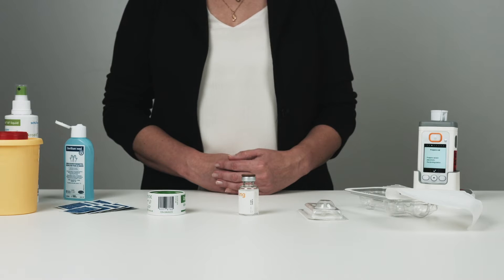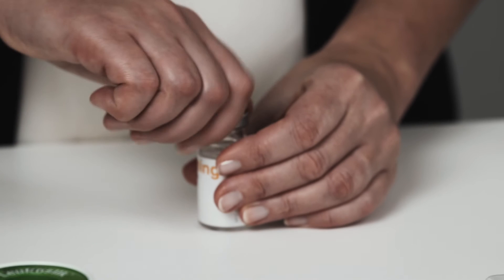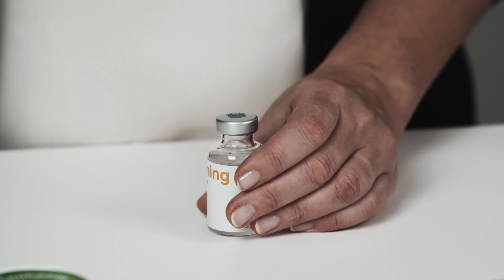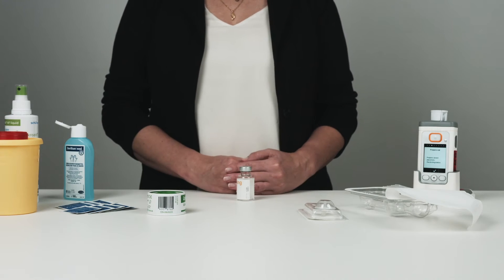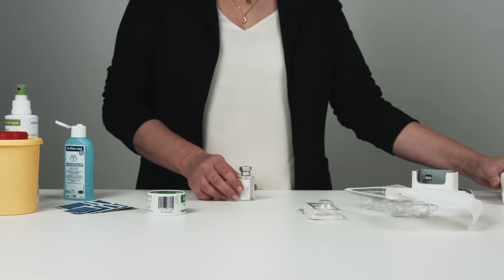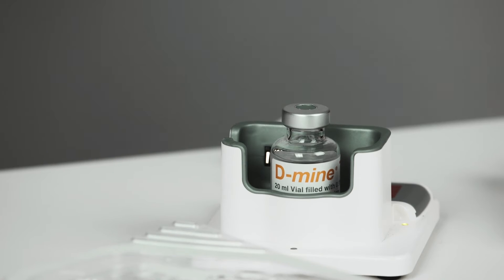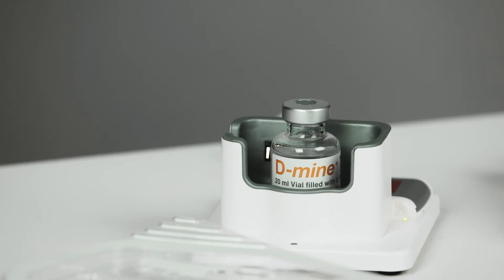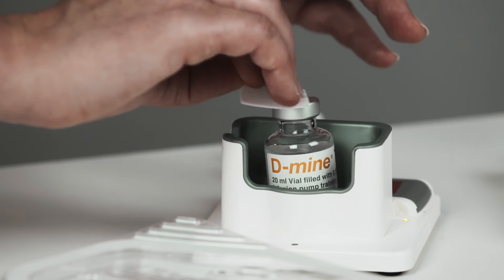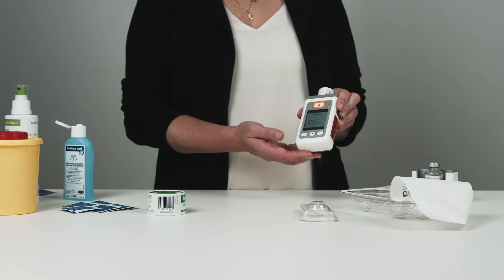Once the self-test is complete, prepare the apomorphine. Take the vial with apomorphine and remove the cap. Make sure you don't touch the top of the vial. Place the medication vial in the center of the docking station, then disinfect the top of the vial with a wipe. Confirm this step by pressing the checkmark button.